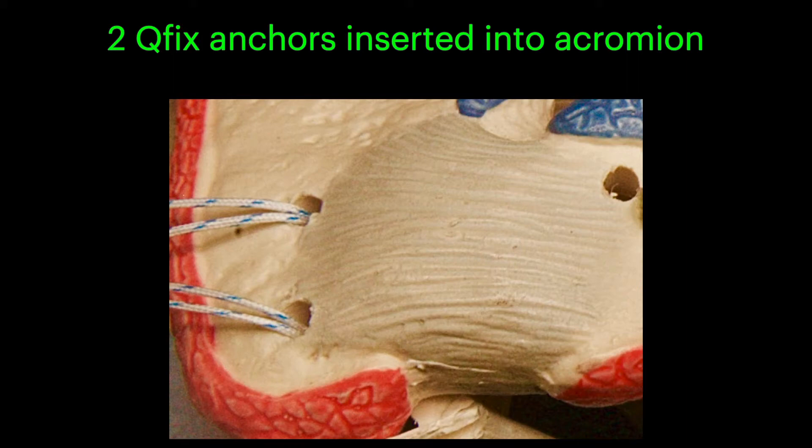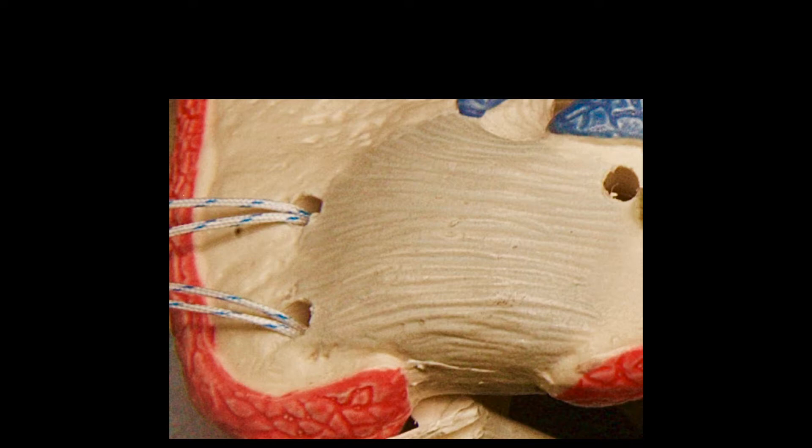The superior surface of the acromion is exposed and two cufix anchors are inserted approximately one centimeter lateral to the acromial joint surface.